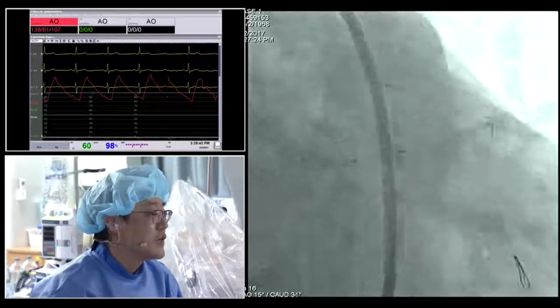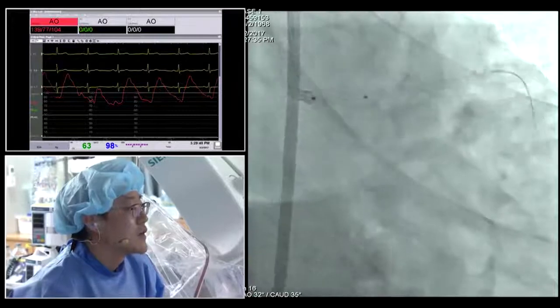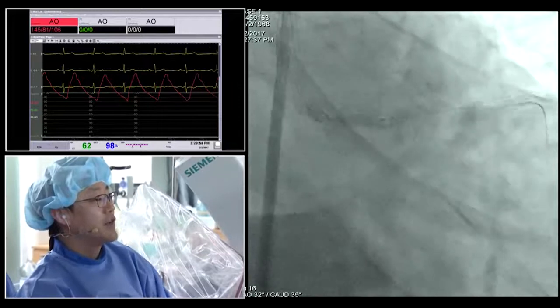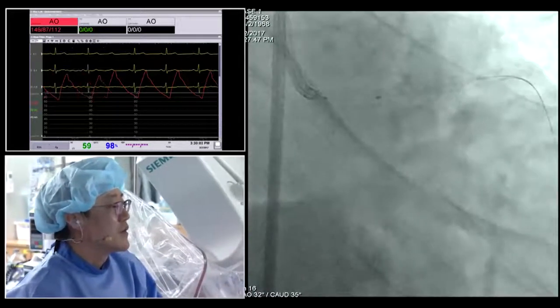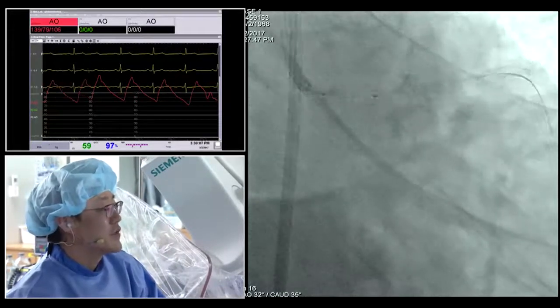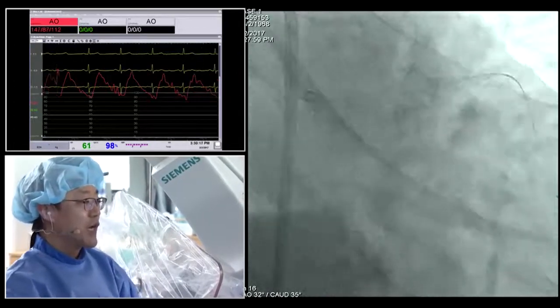Okay, here we are. One more. This is 4. 10, 12, 14. Okay. Very proximal main, and safe. The proximal part of the shaft is optimized for high pressure inflation, to make sure to remove the malposition of the proximal part of the stent. Okay, deflate. And then we like to recross the wire to the circumflex ostium using the hydrophilic wire.